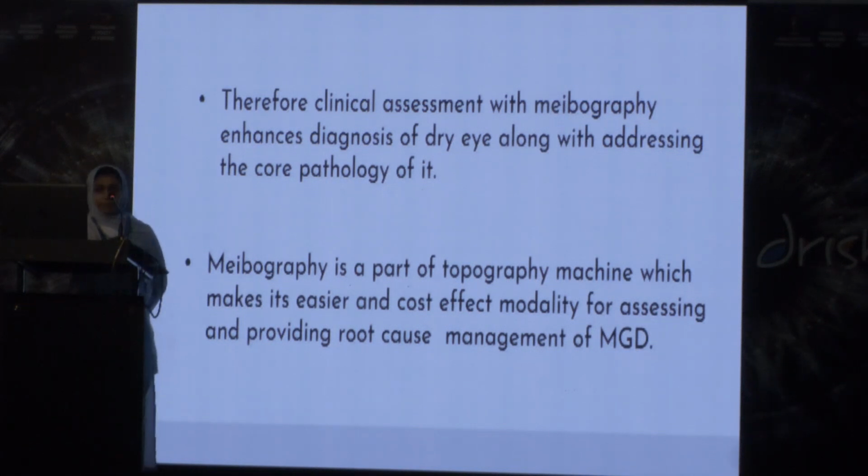Now, the meibography machine is a part of the topography machine, and it is also a part of other machines, so it is easier to undergo this test and it is cost effective.